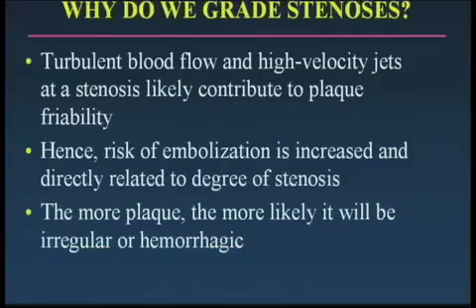And the reason is that when you have a carotid stenosis, turbulent blood flow develops characterized by high velocity jets, and these probably contribute to plaque friability. Hence, the risk of embolization is increased, and that risk is directly related to the degree of stenosis. In other words, the higher the stenosis, the more likely there is to be a high velocity jet, and the higher the risk of embolization.